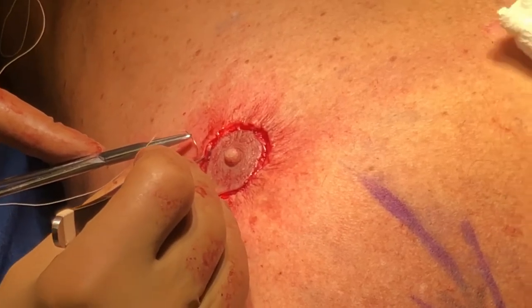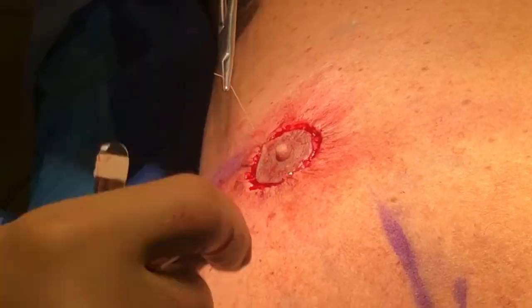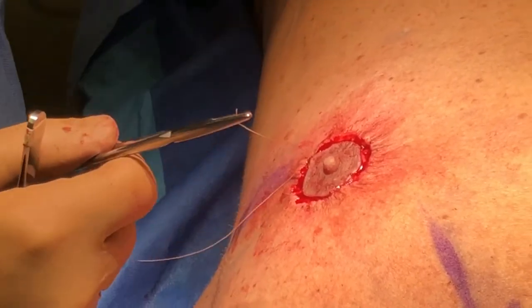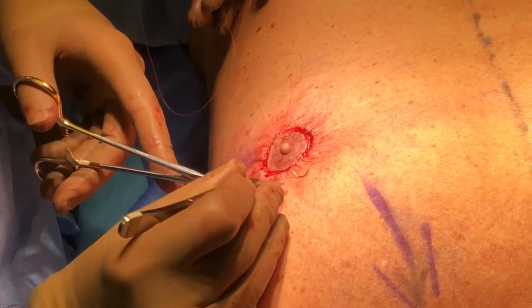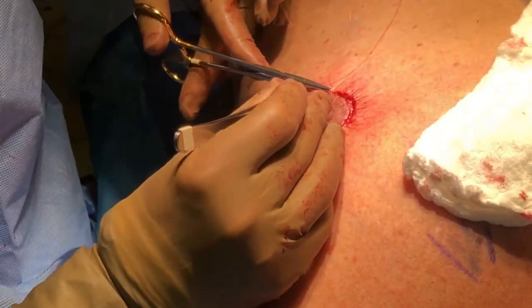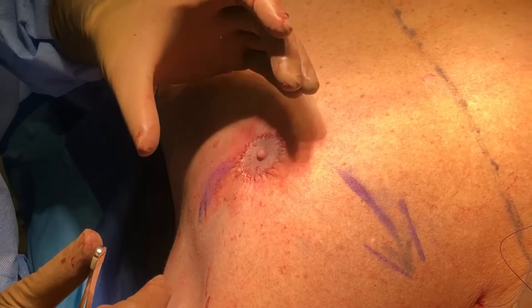So this is the pièce de résistance. This is our 4.0 plain gut. I've tried burying these, but I just find I don't have as much control, so I've gone back to running them right on top of the skin. This gives me really good control of how round and how nice it's going to look. The epidermis together — it's not a lot of strength in this layer; the strength is all in the Vicryl, the 4 and 3 below. This just gets the skin edges to kiss. It's pretty even. I think this guy's going to be very happy. There's no dishpan deformity. There's a little swelling but that'll come down and it's going to be even.